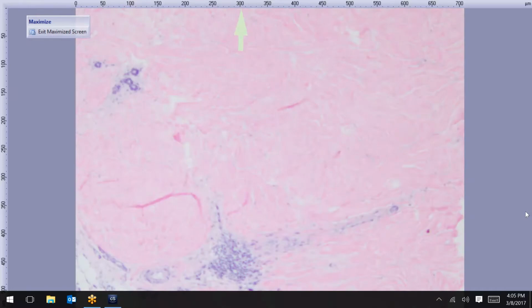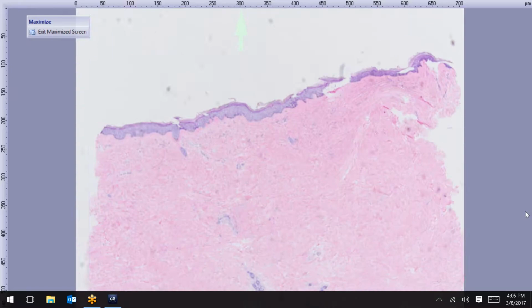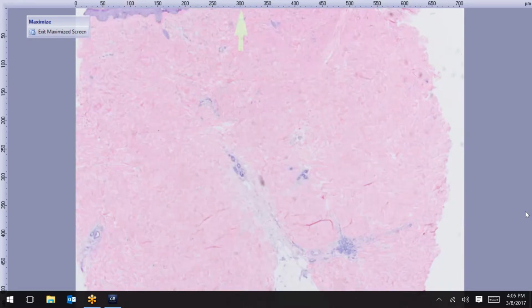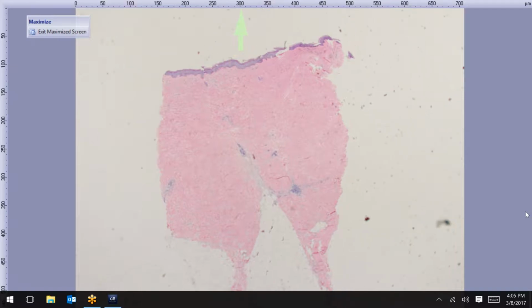Let's do one of these here. All right, I'll go a little quicker through this one. Feel free to put in your guess at this point. I would call it a guess. You guys know these things.